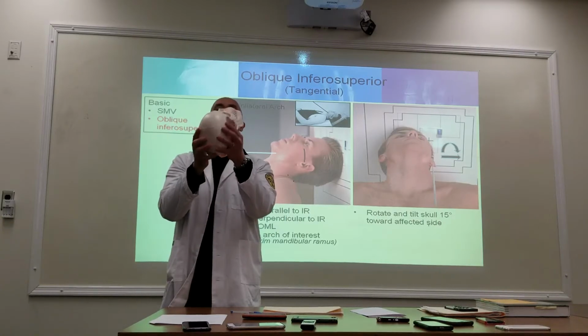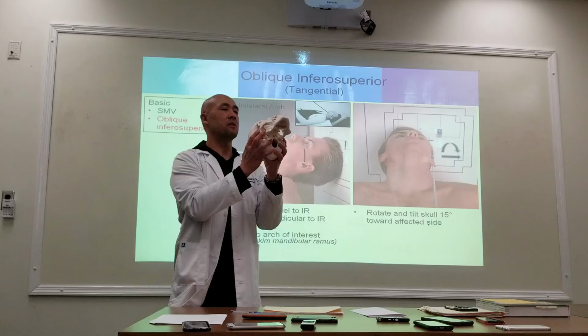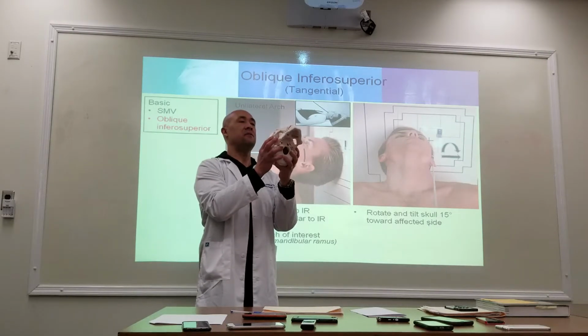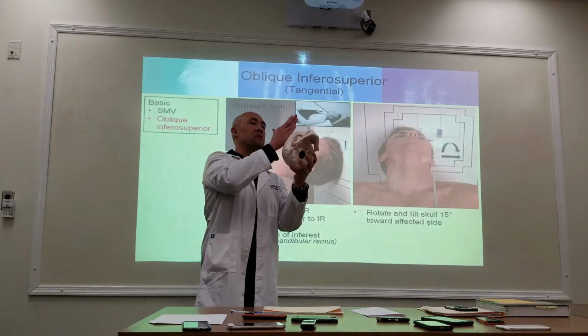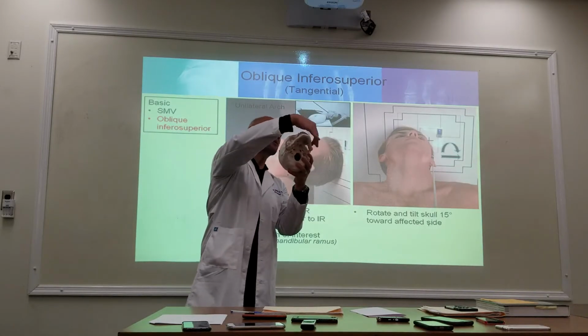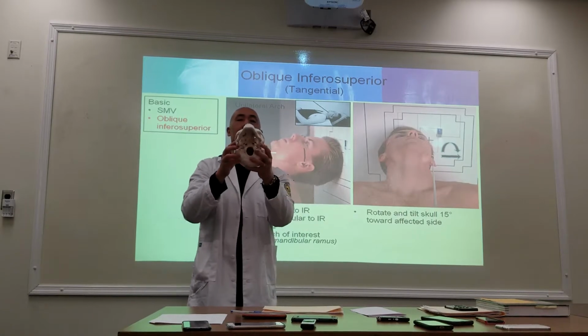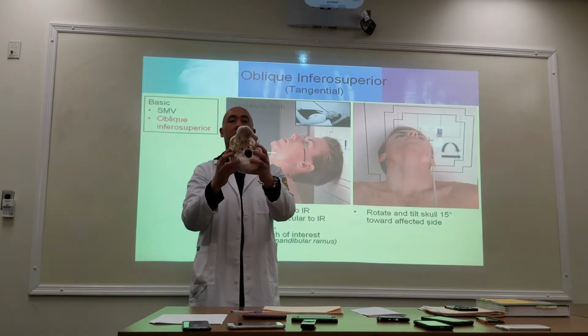Yeah. Because when you tilt it, okay, so you're doing 15, 15. This cheekbone now is superimposed with the skull. This one kind of frees it just slightly. No, it's not superimposed.